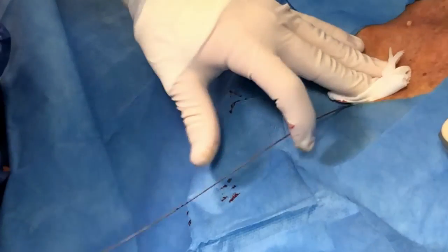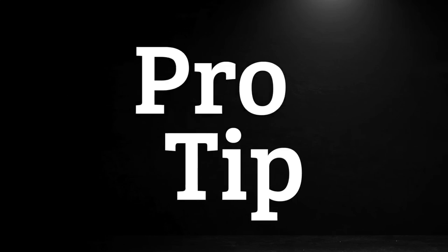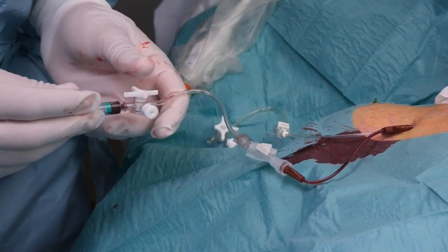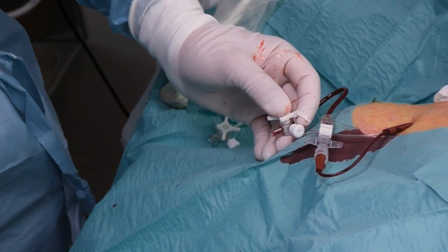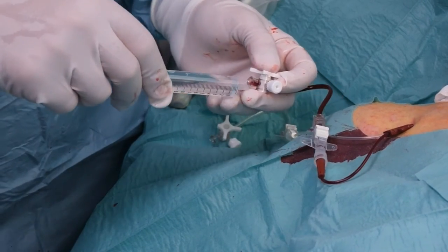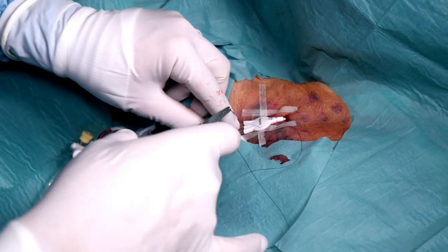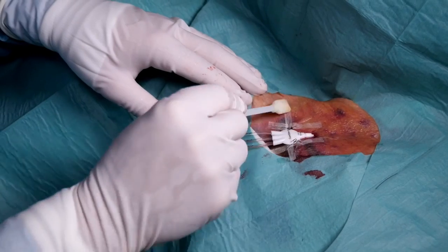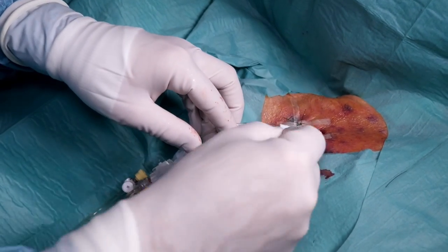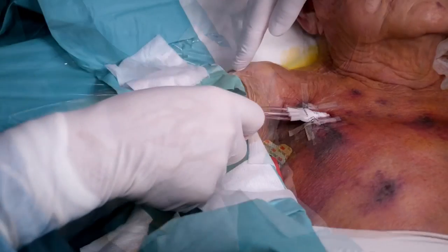When removing the dilator, place a gauze covering the insertion point and make sure to grab the guide wire seam. Don't fill the CVC lumens with saline before the procedure, but rather when it's in place — aspirate blood with one syringe, in this case the 2cc syringe, then inject saline from another syringe to avoid contamination with blood in the saline syringe. Suture through sterile strips to avoid cutting fragile skin, for example in those with long-term steroid use. Then use a barrier film like Cavilon to protect the sensitive skin. Note that despite all our precautions, there's still a small rip of the skin when this drape is removed.